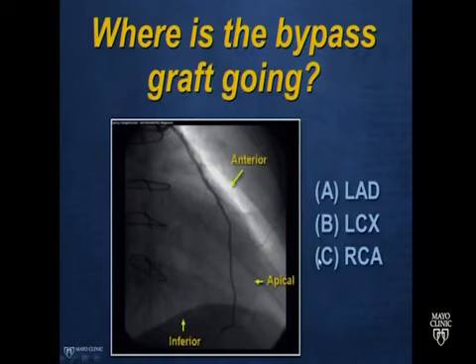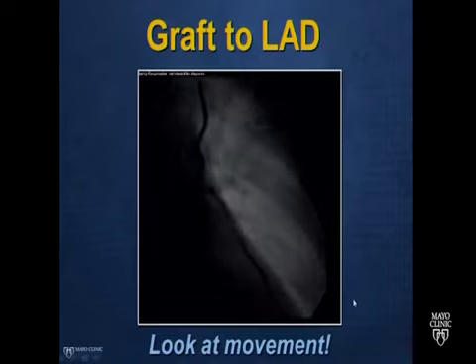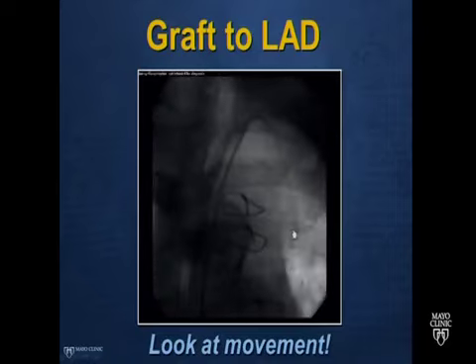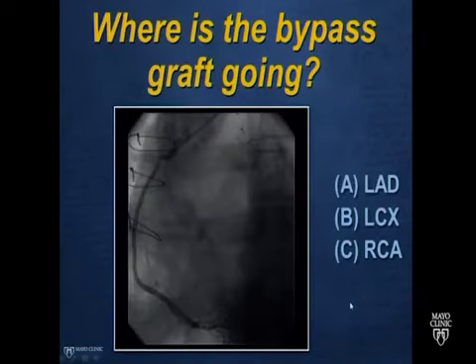Anterior, apex, inferior. And again, it can be helpful to look at the movement, which you might see. This is beating down with each beat. That's the LAD graft. How about this one?